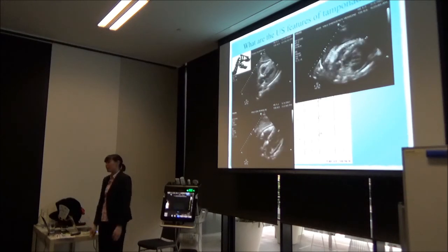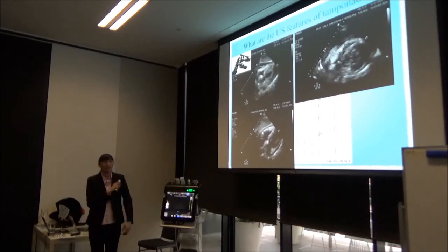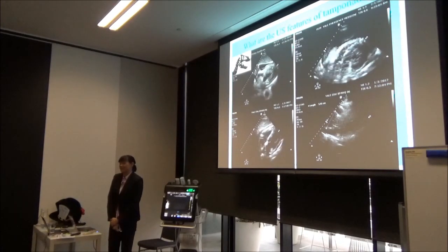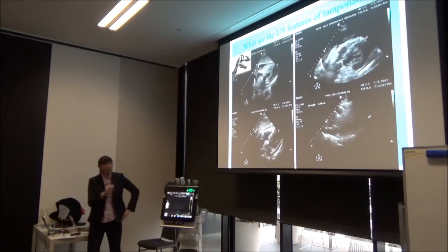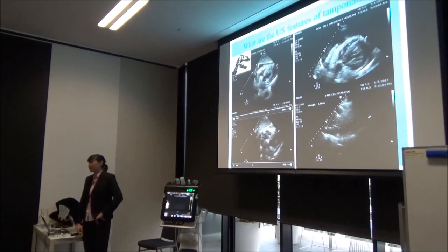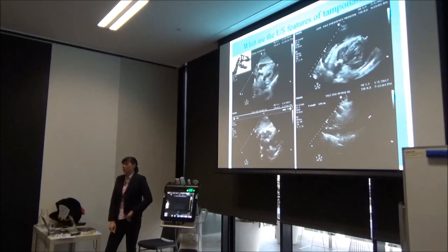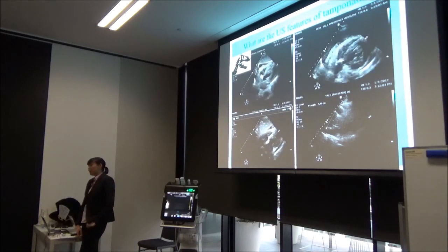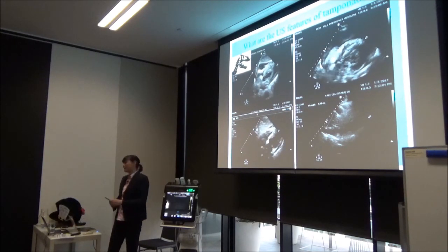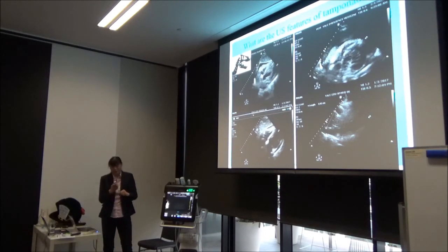Okay, so I said, why are you getting so excited? Because I still don't have tamponade. This person isn't in distress because of tamponade. Why are you so worried? Then she was like, Rachel, a dilated thoracic aneurysm with an effusion is always going to trigger the alarm, something is dissecting and rupturing. Right? So this guy goes to the OR within 2 hours and is saved after having 50 units of blood, and is quite delighted with his diagnosis because now he thinks he's got a reason to sue the government, which I would have supported him with.